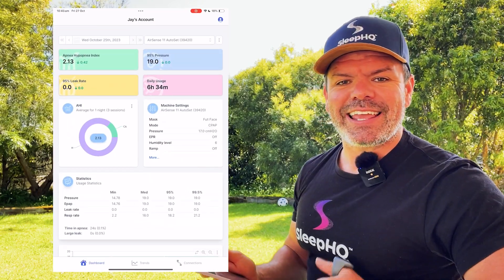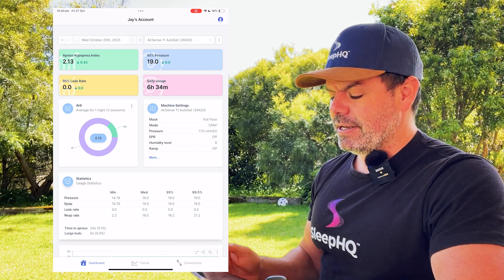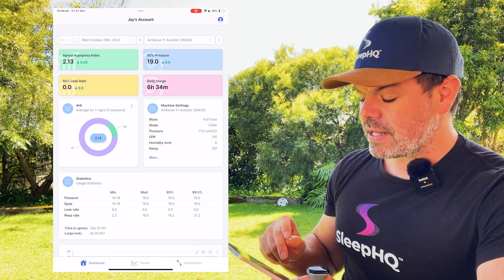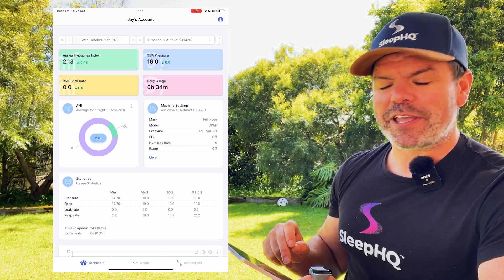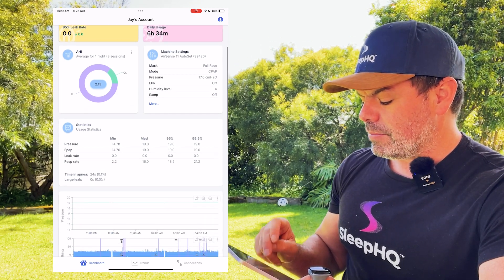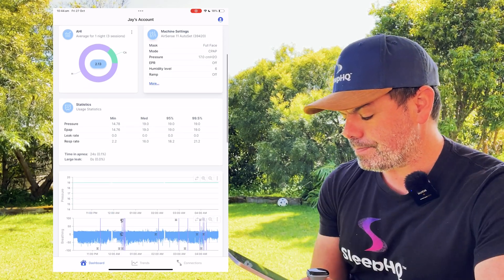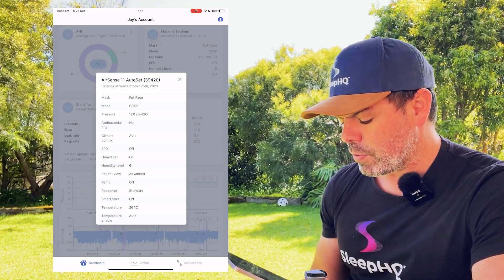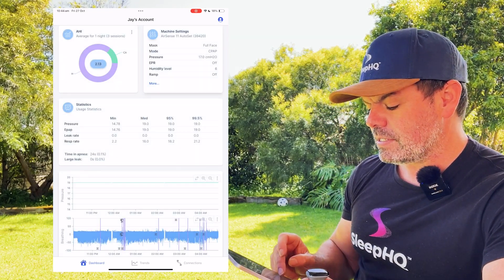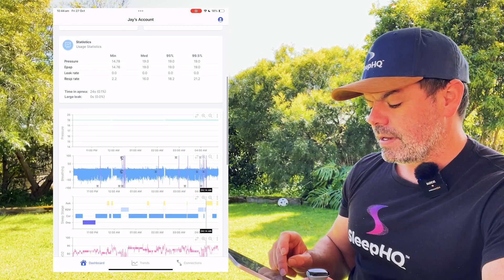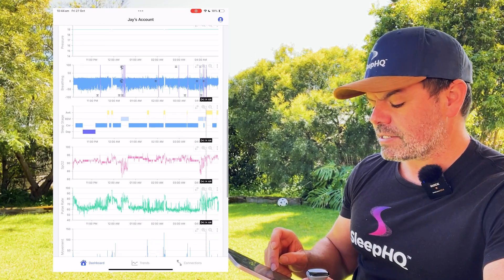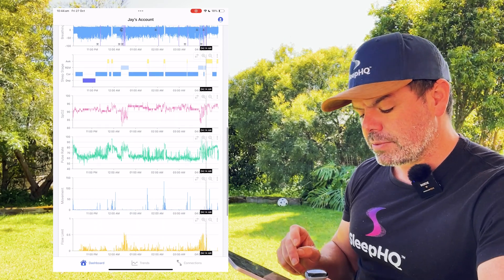We're checking out Jay's account. Not a full detailed analysis today — just a little swipe through so you can see how it looks. I've got the summary data there, machine settings, the AirSense 11 Auto Set with EPR off. Great statistics.